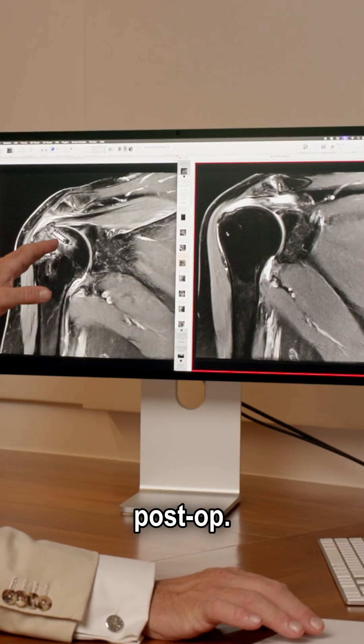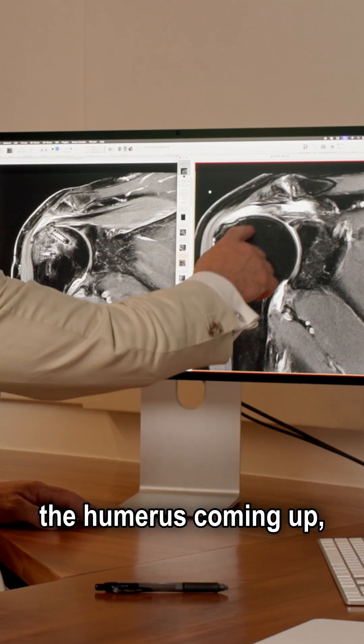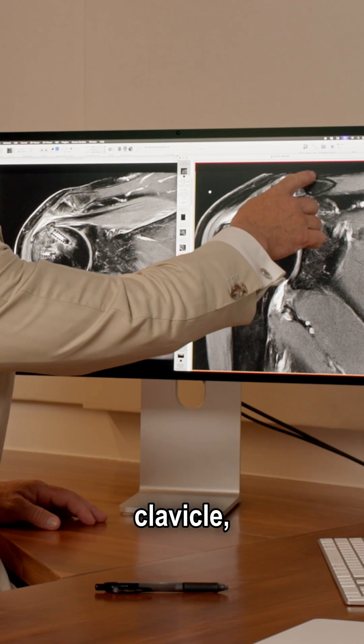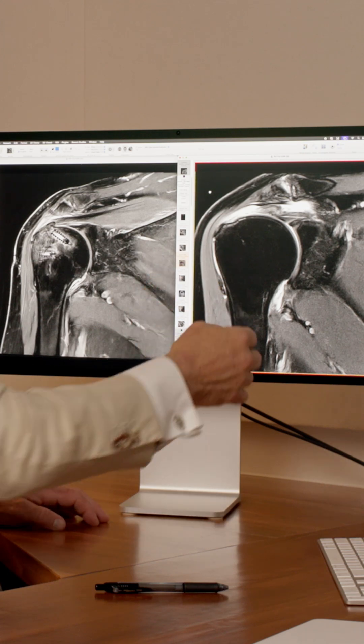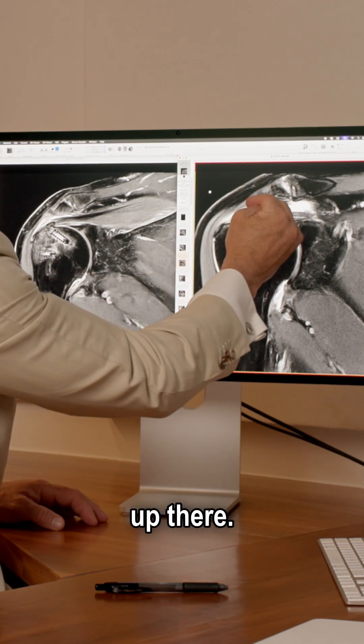So this is pre-op here, and this is post-op. Pre-op, we can see the rotator cuff tear. You can see the humerus coming up with the ball, the socket, the shoulder blade here. That's the acromion. That's her AC joint. That's the clavicle. This is skin. This is the rotator cuff muscle on the top of the shoulder — the supraspinatus muscle. It forms a tendon, and the tendon comes across here. And you can see it's wavy — it's curled up there.